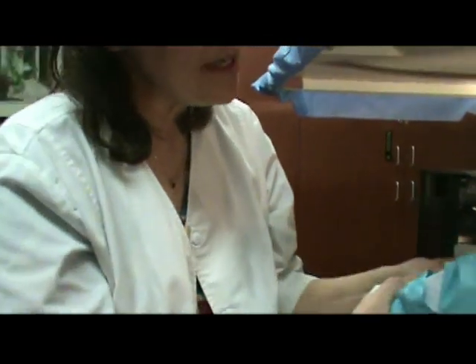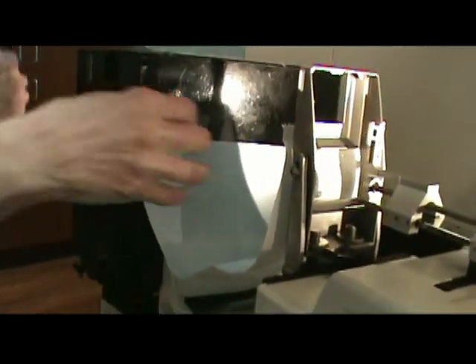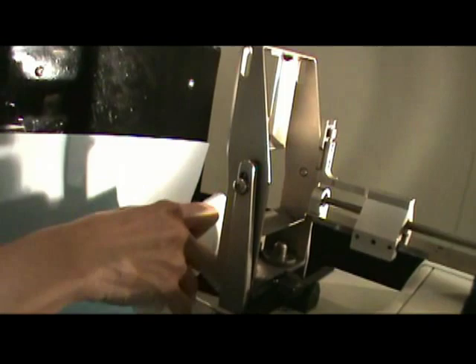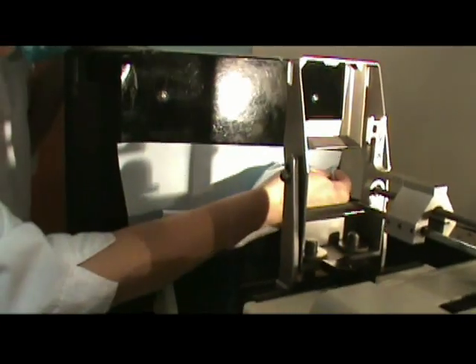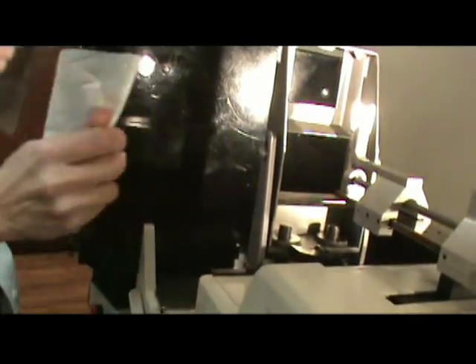If it was still one piece, you would just separate it as I showed earlier and take it off as a two-piece system. On this piece, take it out from the front of the biopsy paddle — I always tuck that underneath — then start rolling it again. Grab right where those sticky tabs were, fold it in, and put it in the trash.